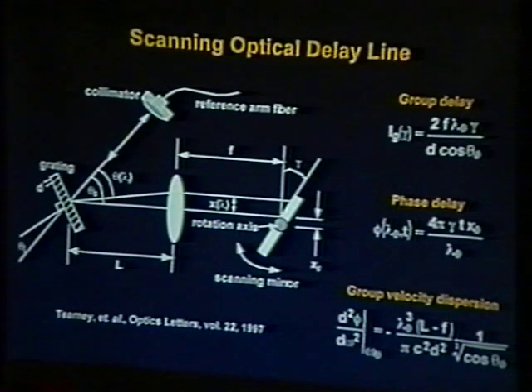So in order to match the transverse to the axial resolution, you really need to scan the focus in a manner analogous to confocal microscopy. I said we match them, and it's actually a 2-to-1 ratio. We use a transverse resolution that is twice the axial resolution.